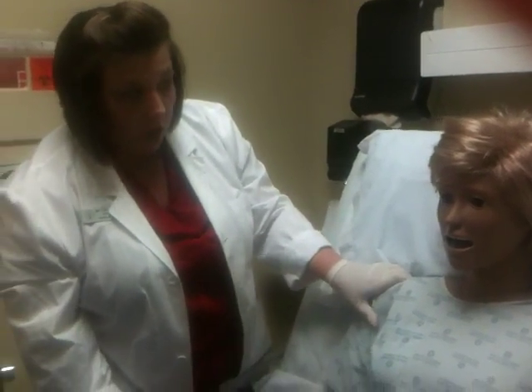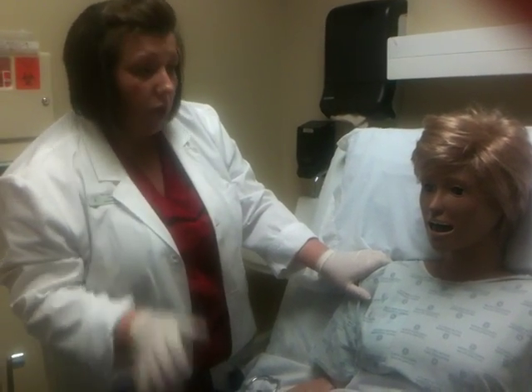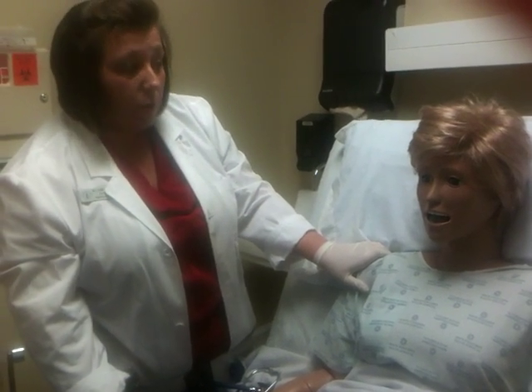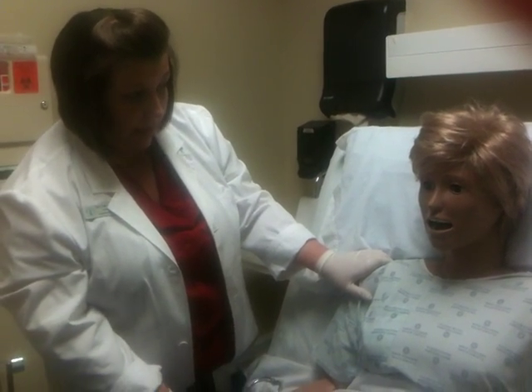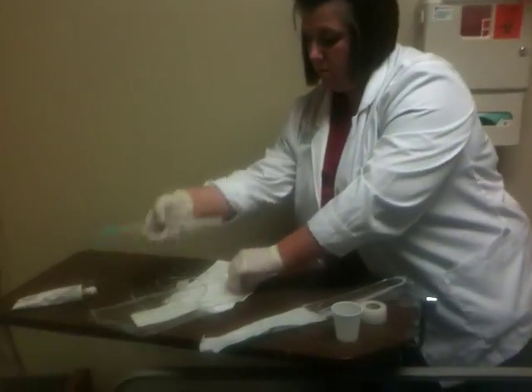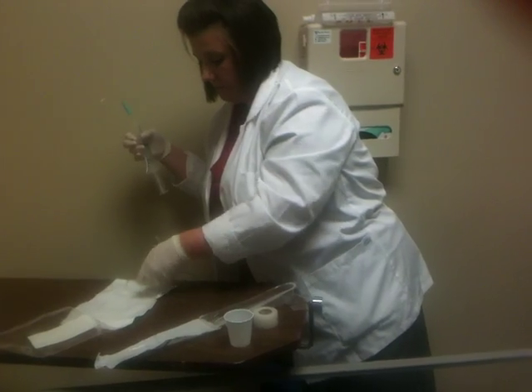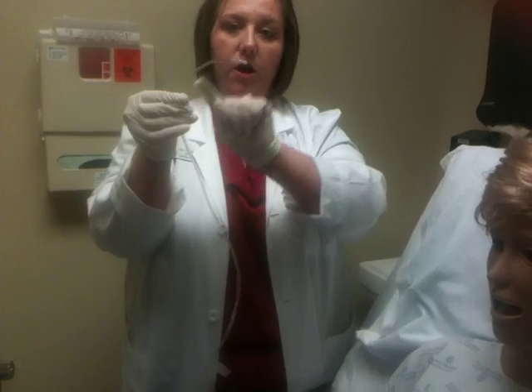It's going to be a little bit uncomfortable. What I need for you to do is if you start feeling like you can't breathe, you wave your hand at me and let me know, okay? I also want you to give me a thumbs up if you feel this in the back of your throat, okay? So I taught her 2 different signals so I would know what she needed, okay? All right. I'm going to go ahead and lubricate my tube very, very well. You need to make sure that it's curving downward.